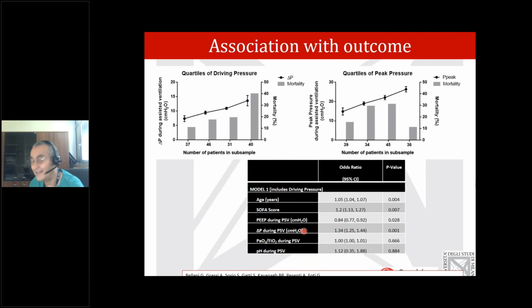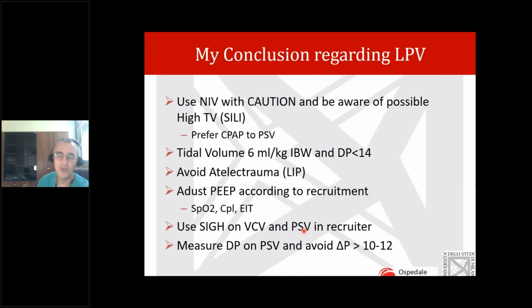So in my clinical practice, I concentrate very much that my patient does not have a driving pressure exceeding 10, 12 centimeters of water.